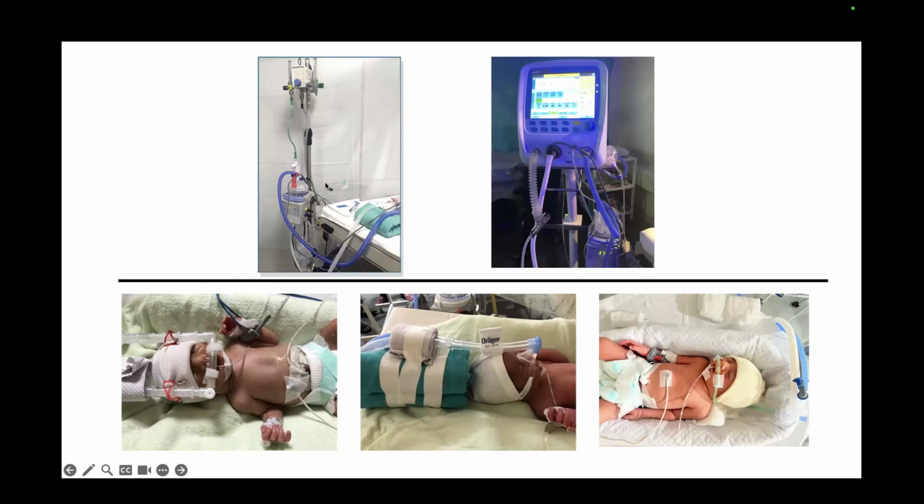The interface between the nose and the CPAP circuit is either a binasal prong or a mask or a Ram's cannula. When you're fixing the mask or nasal interfaces like nasal cannulae, you have to ensure that they're snugly fitting the nose, not over distending. If you're using the mask, there should not be any leak. So you need to connect the nasal mask, and the nasal tubing should be well supported.